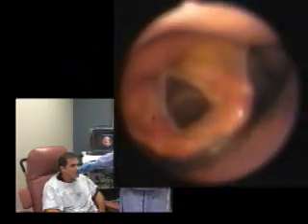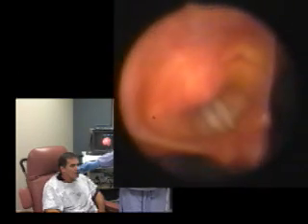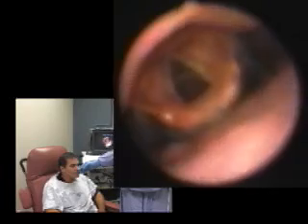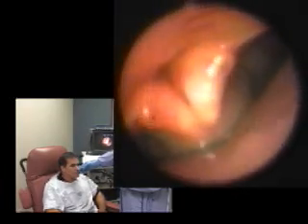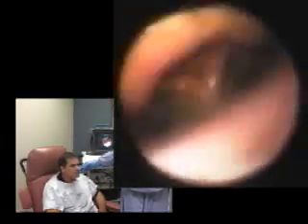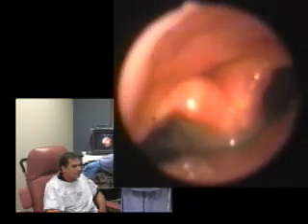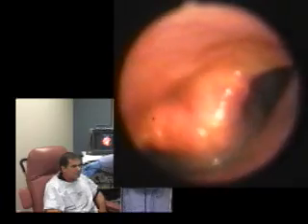Could you kindly give us an E, a long E? See that cord is functionally intact, so it can adduct normally. Thank you, Chuck. And now could you bear down like a Valsalva, like moving your bowel? Just, yes, that's a Valsalva maneuver. Relax. Do it again. You see the cords close, and then the adducted arytenoids seen here goes to the base of epiglottis. So you have two tier of closure.